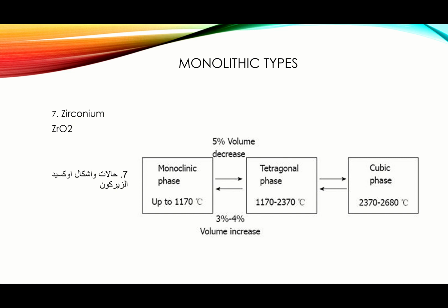Now let's establish something here, that all we're talking about is zirconium oxide. It's the same composition. It's zirconium oxide, all right? These are phases, the way the molecule looks, the way the molecule of zirconia is formed. This form of the zirconium molecules gives you different physical properties. Some of them are very desirable, like tetragonal and cubic. Some of them are less desirable, like the monoclinic.